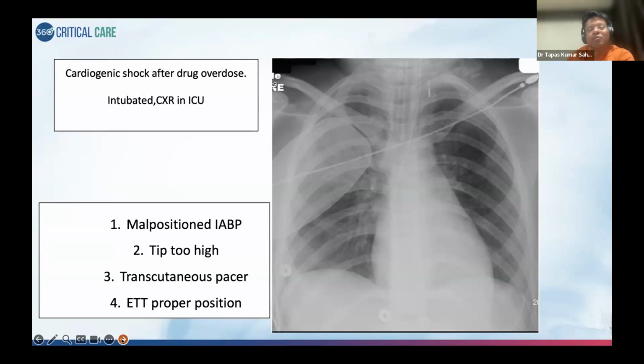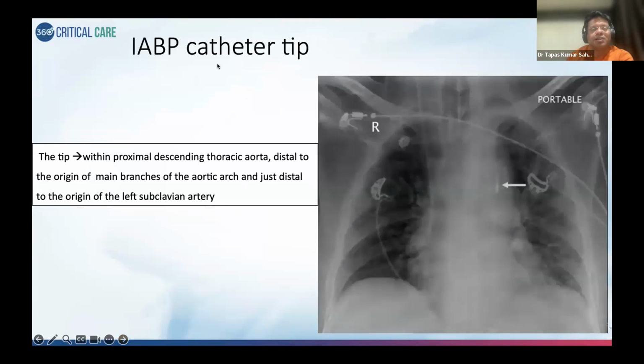Now you know how to answer, because the examiner would not be giving you only one line or device in the X-rays. They would have multiple things. Now this has been discussed in detail by Dr. Sanand, so I'm not going into detail.